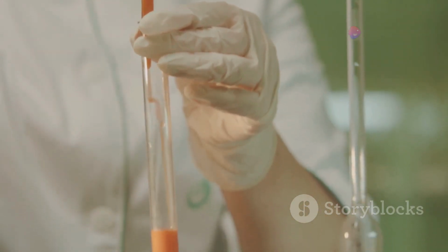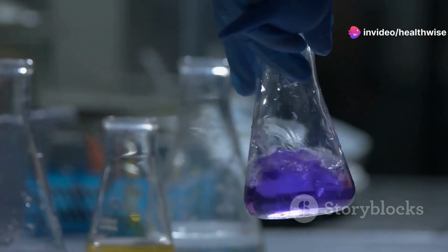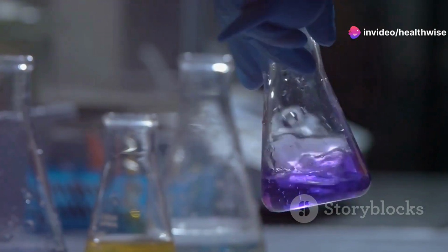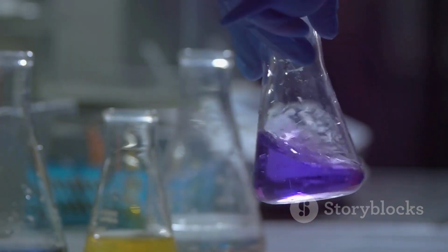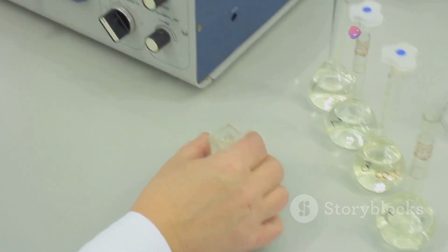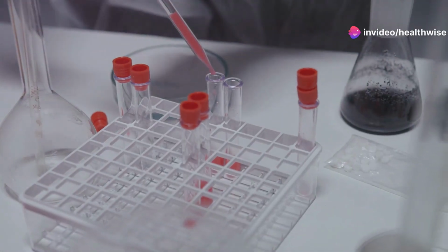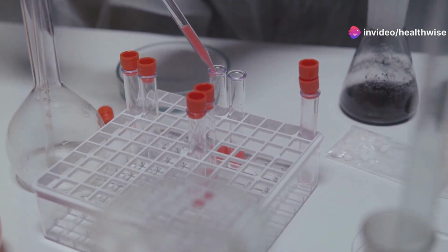Alright, let's move on to the Pyrogallol red dye test. This one's a bit more precise. The principle here is that the Pyrogallol red molybdate complex forms a violet-colored compound with protein at pH 2.5. You measure this at 600 nanometers using a spectrophotometer. It's super sensitive and works for both urine and cerebrospinal fluid, CSF.